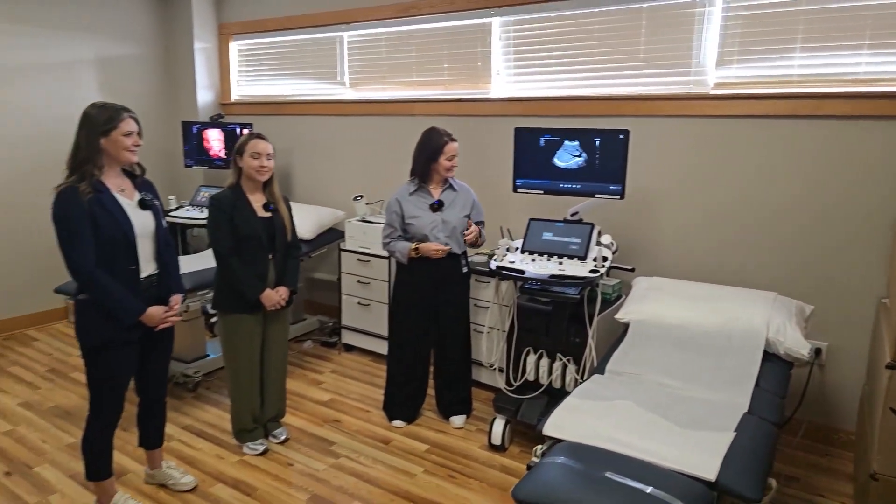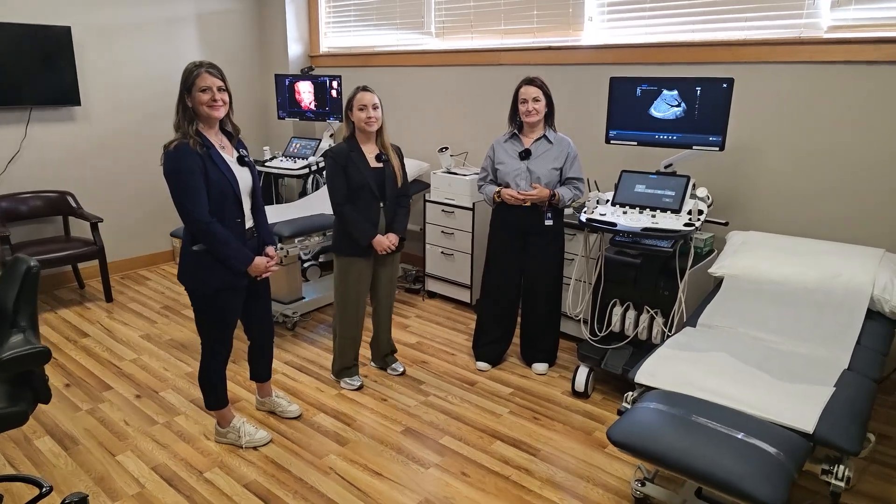We have multiple units set up in this room. I'm Tanya Rattay, Education Manager here at Samsung. I'm Stephanie Durham, and I lead the radiology clinical team. You guys have multiple units set up — full of ultrasound.